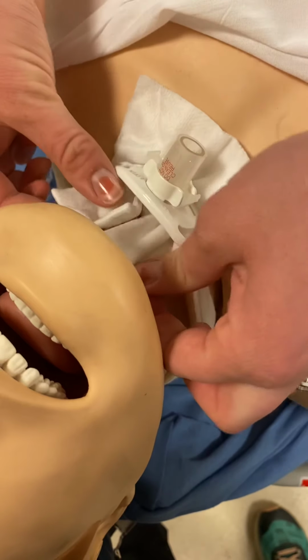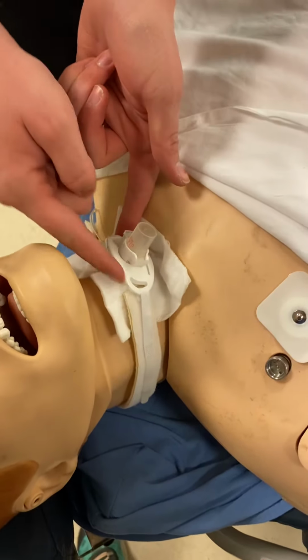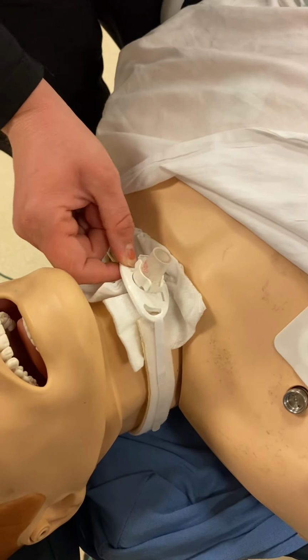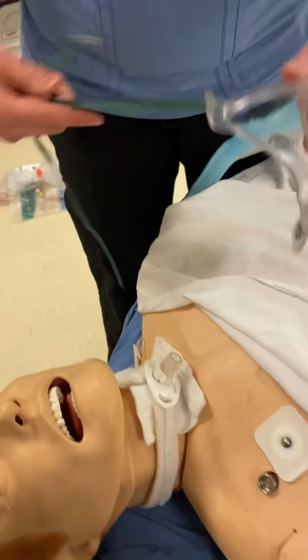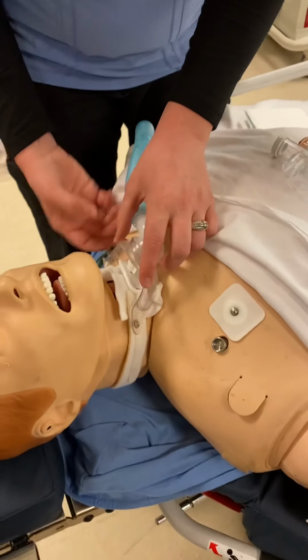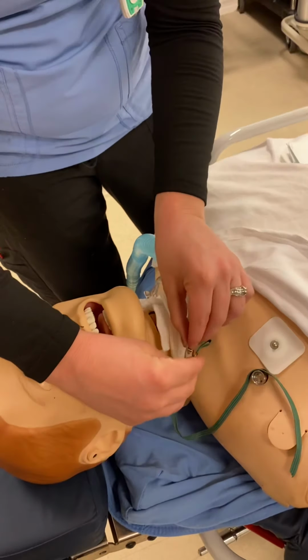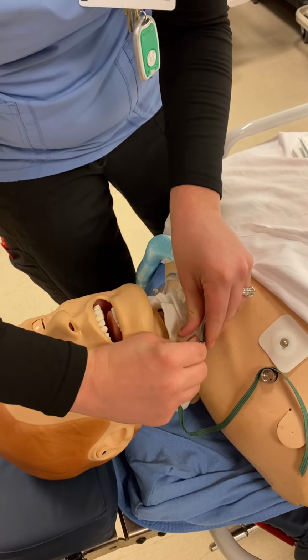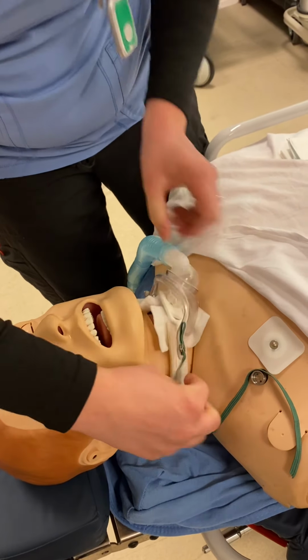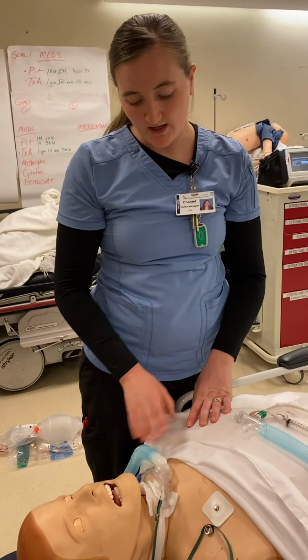Okay, you're going to put that dressing in place, making sure you're at least covering on all sides of this flange piece here. And then you're going to put the patient's oxygen back on. Okay, so that trach mask is going to go on top, and then just secure it again here. All right, and that's how you do your trach care, your stoma care, and changing out the inner cannula.